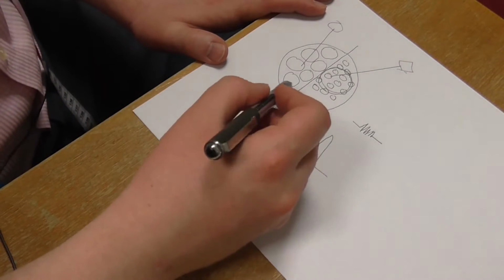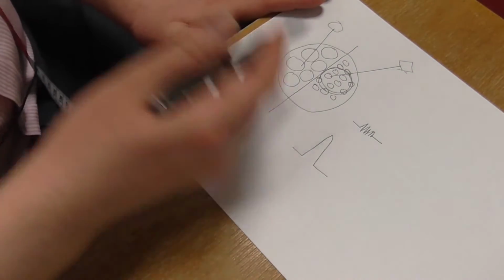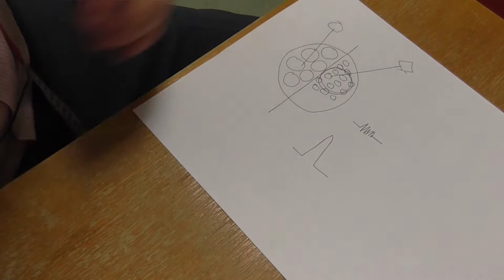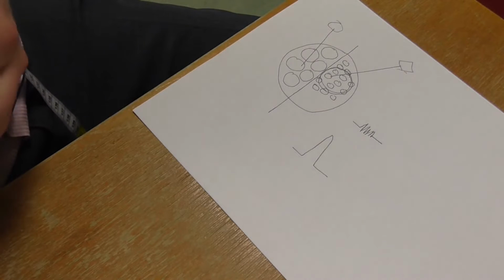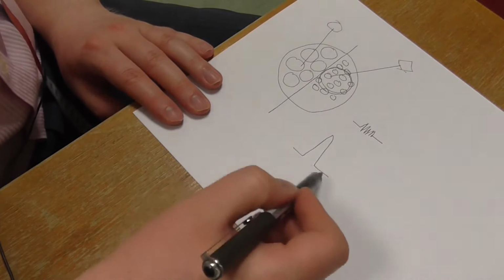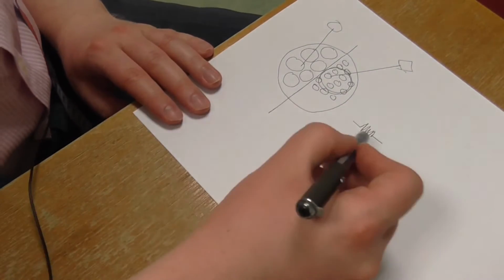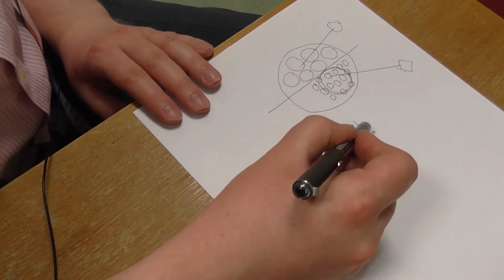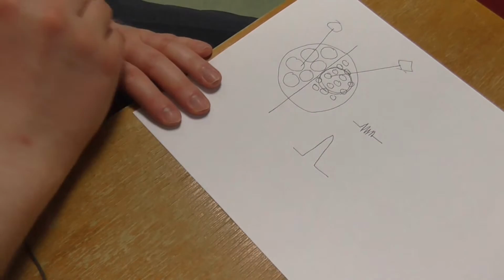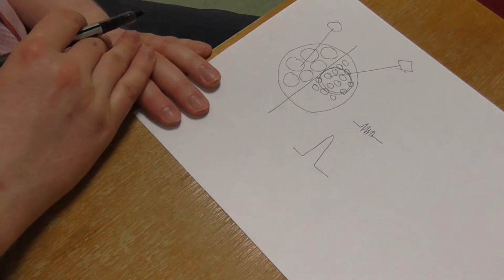So in a normal situation with a normal muscle, we're able to pick up with a green concentric needle electrode between 5 and 7 muscle fibre activities, and they'll summate to this motor unit action potential like so. In the disease state with myopathy, we're going to pick up lots of small motor unit action potentials which look polyphasic as opposed to this large motor unit action potential.